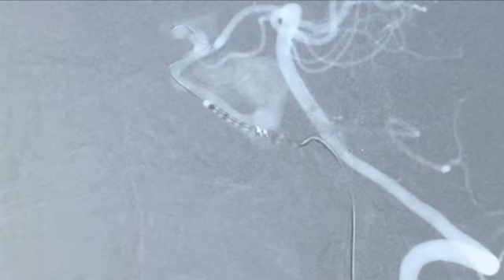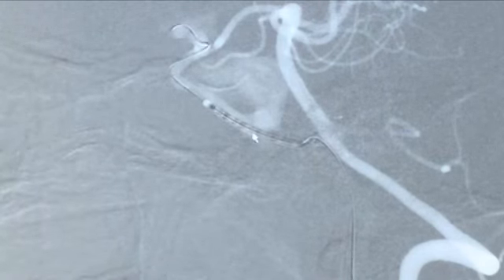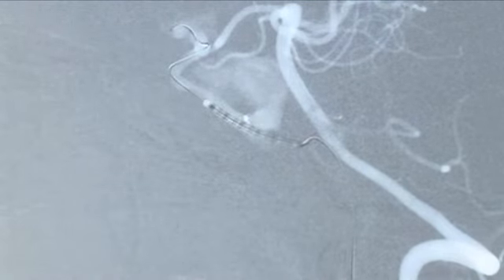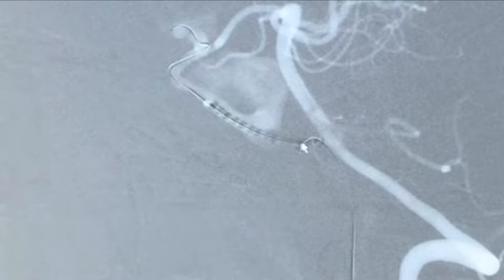So I just pulled my Graftmaster a little bit and then started deploying over here, and this is the site of the fistula, covering from about 3 millimeter from here and about 3 millimeter from here. This is a 3.5 by 19 Graftmaster, and nicely getting deployed over here.